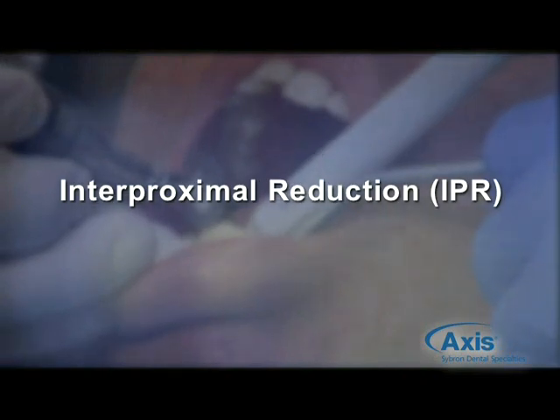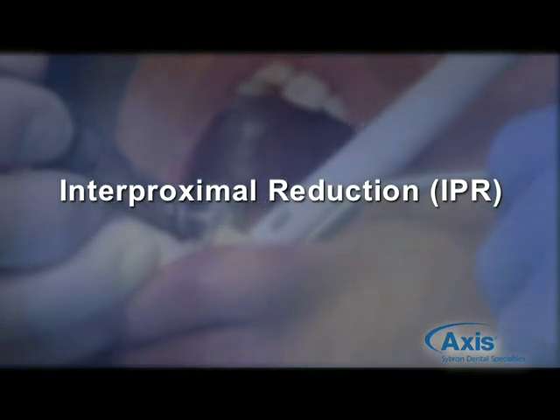One of these challenges relates to creating space between teeth by removing minute amounts of enamel so that the teeth can more freely move into their final desired position. This technique is called Interproximal Reduction, or IPR. Each of us had developed over time similar strategies that made this technique fairly straightforward, easy and predictable.